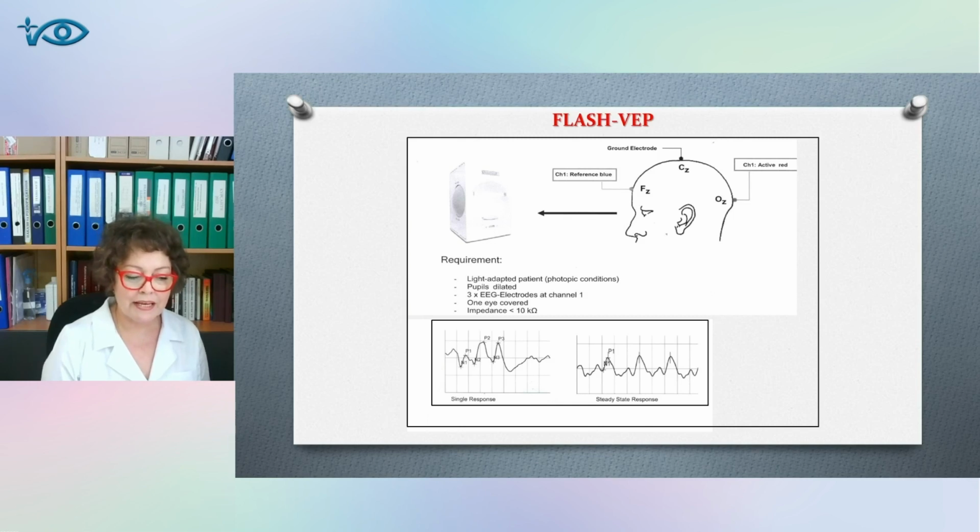In a number of cases, the study of flash VEP is used as an additional and demonstrative research method. So, following acute cerebrovascular accident, the decrease in the amplitude of components and the increase in their latency on the affected side of the brain compared to the intact hemisphere are found.